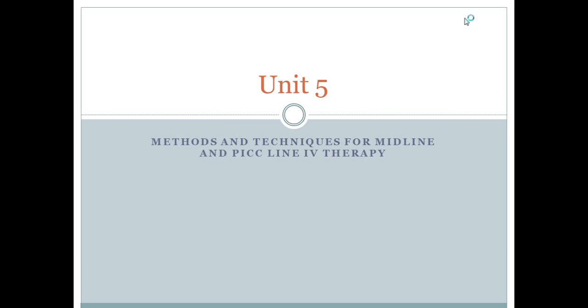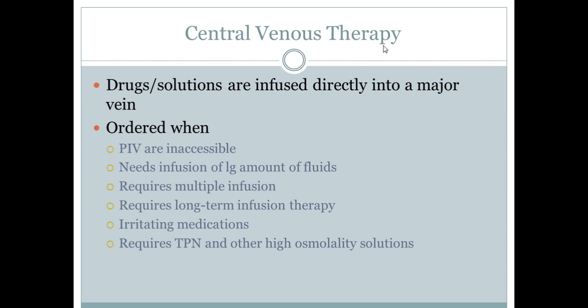Unit 5, Methods and Techniques for Midline and PICC line IV Therapy. In this unit, you'll notice there's going to be a lot of commonalities between what we do with our peripheral IVs compared to those with the PICC and the midline. I'll be highlighting mostly the stuff that is going to be different, but you'll see there's going to be a lot of overlap.